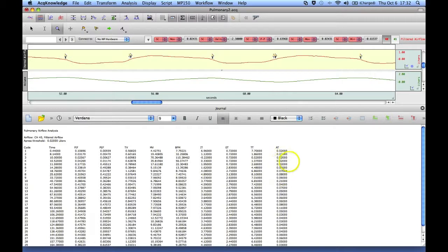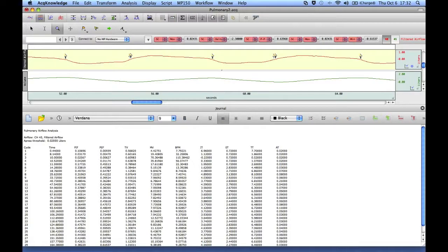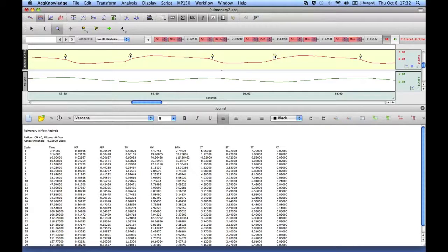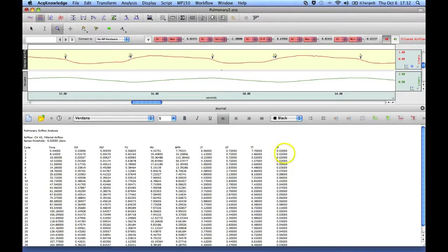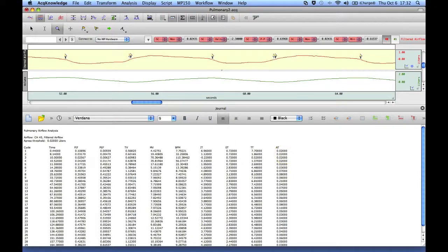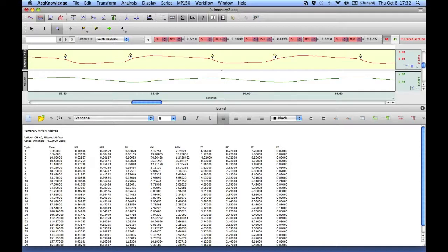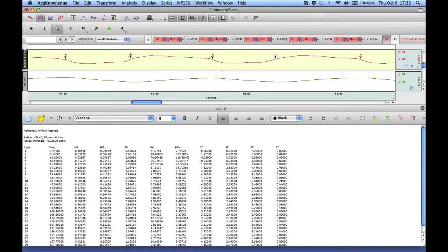And apnea time is the amount of time that the signal remained constant at the threshold. So we set 0.02, and this is telling us how long the signal stayed at that level for before it started rising up to be identified as the onset of inspiration.